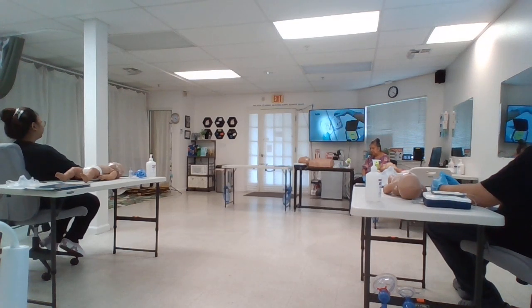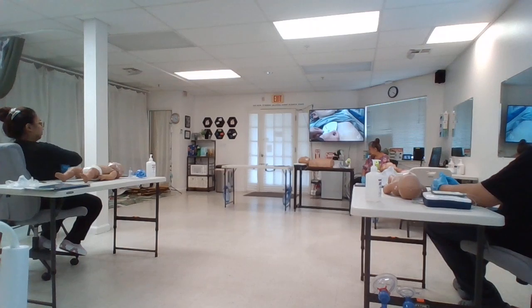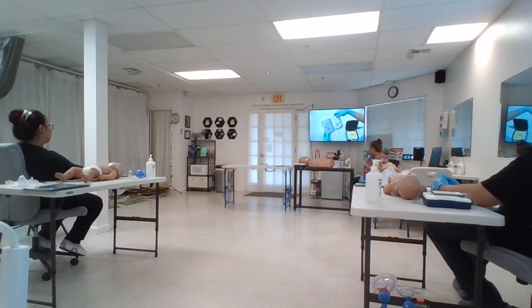If not, use the adult pads, but make sure that they do not touch or overlap. But never use the child pads for an adult. The shock dose delivered by child pads is too small for an adult and likely won't be successful. It's better to provide high-quality CPR than attempt to shock an adult with child pads. Some AED pads recommend placing one pad on the chest and one pad on the back for infants and children. Follow the pictures on the pad packages for proper placement.